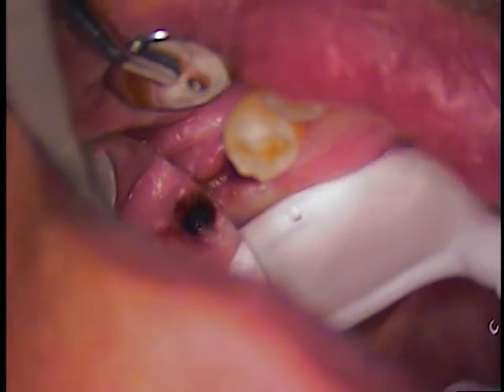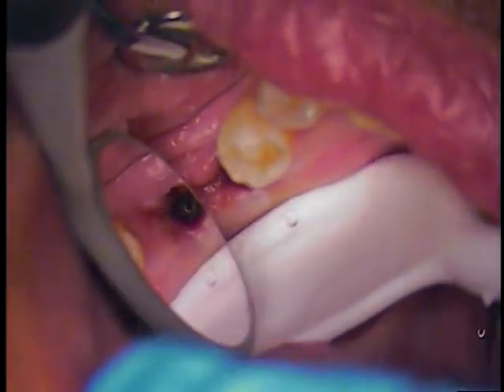Hold. Okay, guys. Drop it down one more time. I'll get one more chance to clean these threads. Okay. Hold.